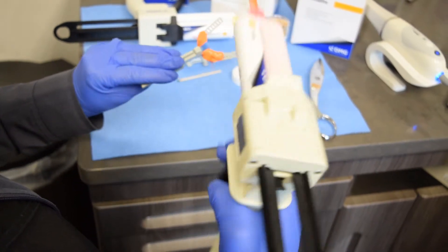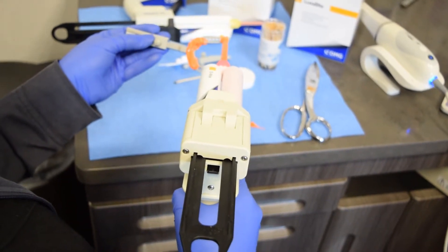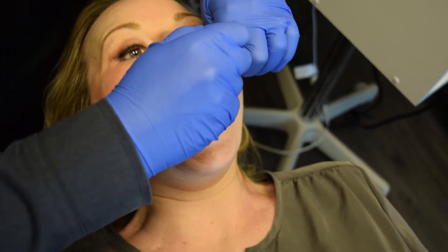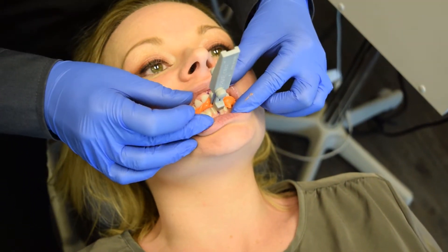Just enough — you don't want to cover enough to lock into any undercuts, just enough to get an indentation. We're going to place this in the mouth and make sure the midlines are lined up the way they should be. I would definitely take the patient's lips and kind of fold them, just to get enough indentation of the teeth there.